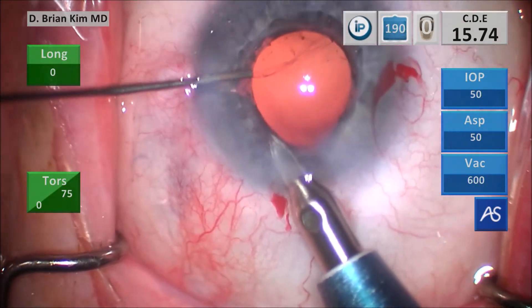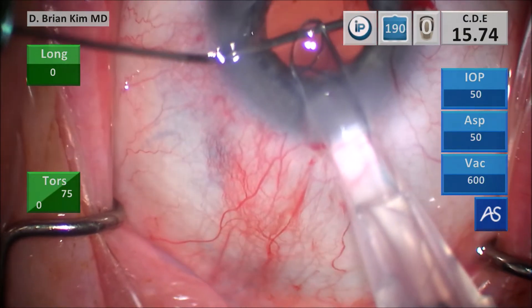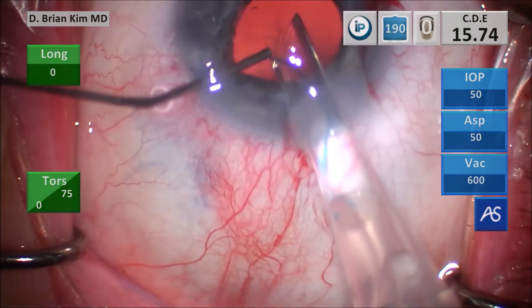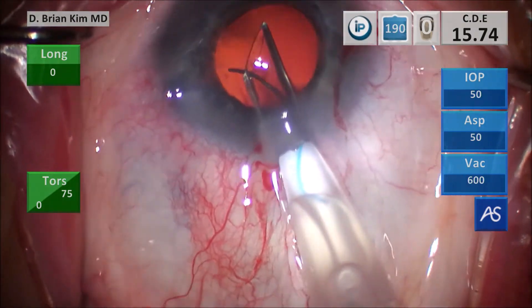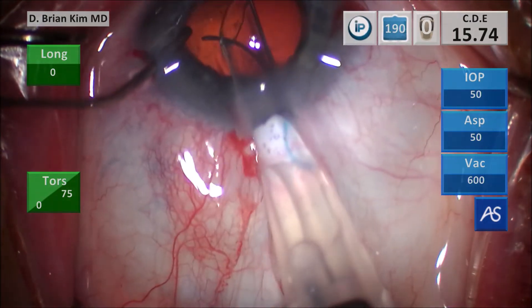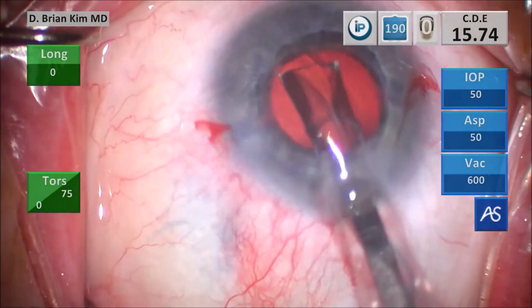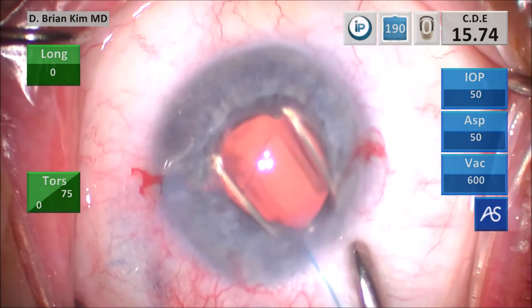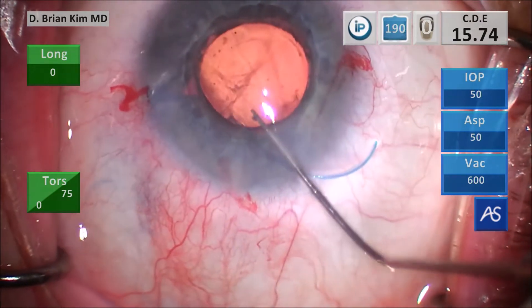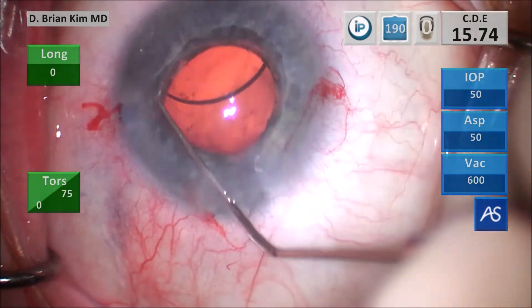I'll optic-capture the optic through the rhexis opening in a buttonhole configuration — by doing it that way the optic will be stable and the lens will not be rotating and propelling in the sulcus space. As I push the injector in it causes viscoelastic to come out, so it's very important to push viscoelastic simultaneously to stabilize the chamber. I push some more cohesive viscoelastic, turn the eye away from me so I can see the rhexis edge, and push the leading haptic into the sulcus space, visualizing it confidently. Then I dial the trailing haptic into the ciliary sulcus — now both haptics are in the sulcus.